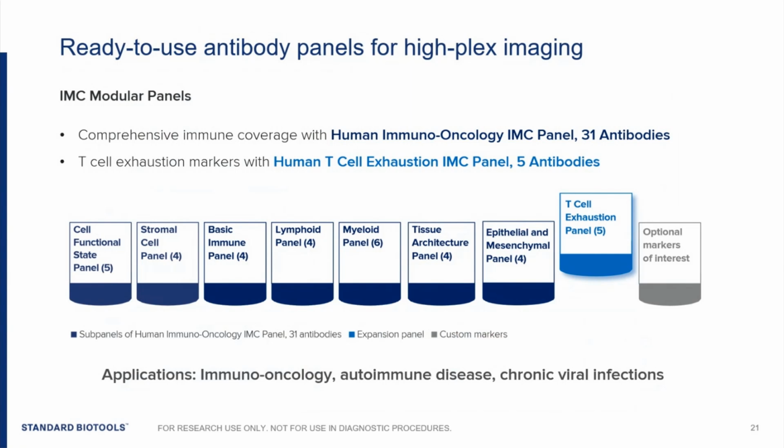so long as it has some previous history of working with immunohistochemistry or immunofluorescence, the clone will most likely work then with imaging mass cytometry.